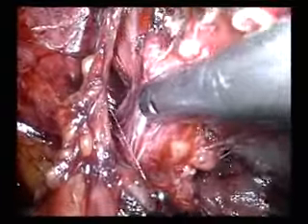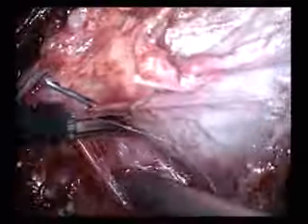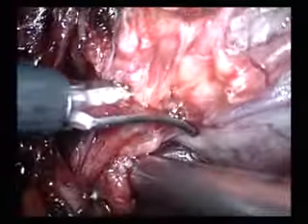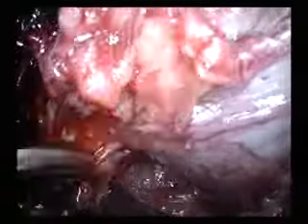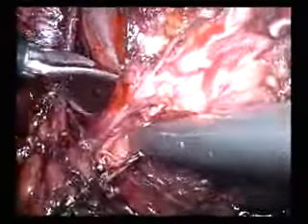At this point of the procedure, the Sonosurge device can only be used for blunt dissection to avoid any thermal damage to the nerve structures. Again, the plane surface of the prostatic capsule is clearly seen laterally as well as posteriorly.